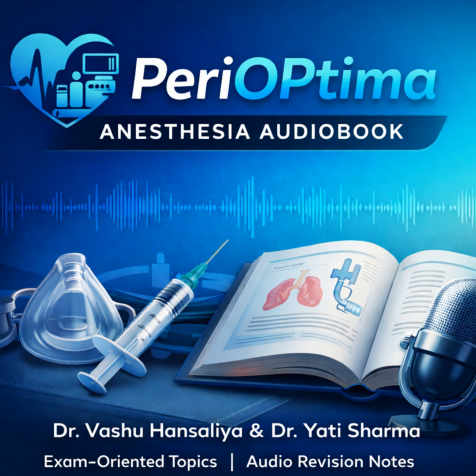Yeah. If the right hand sats are low, say 85%, it means the brain is getting hypoxic blood from the failing lungs, even if the pulse oximeter on the foot is reading 100%. And arterial lines. Ideally, you place the arterial line in the right radial artery to match the SpO2. This gives you the true cerebral perfusion pressure and allows you to sample blood gas from the native circulation. And I should be aware that the waveform might look different. Yes. In full VA support, the arterial line might look flat. It will be non-pulsatile.